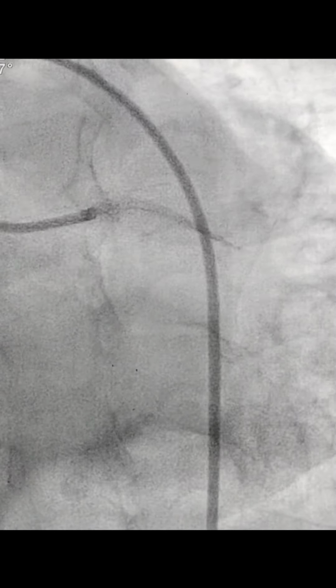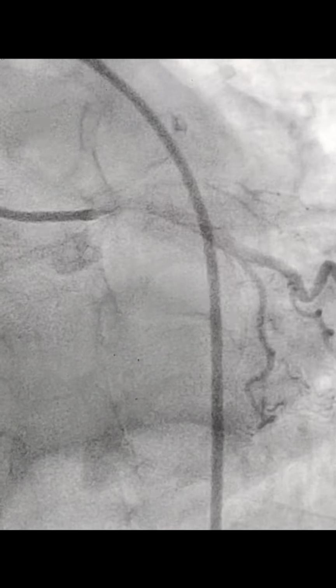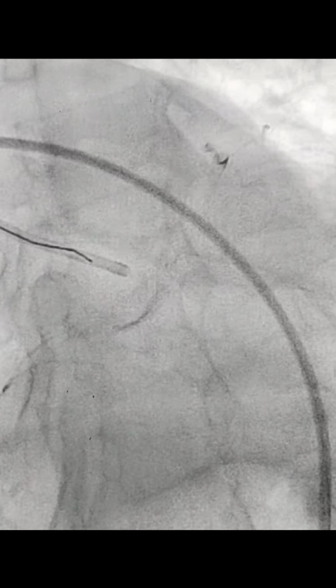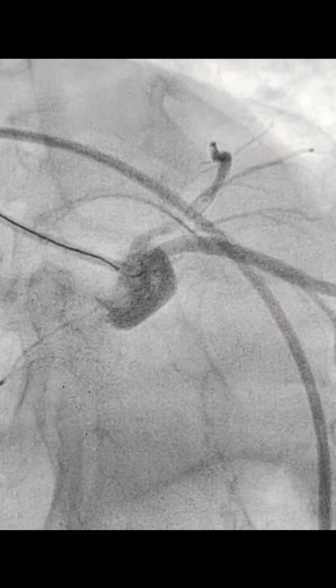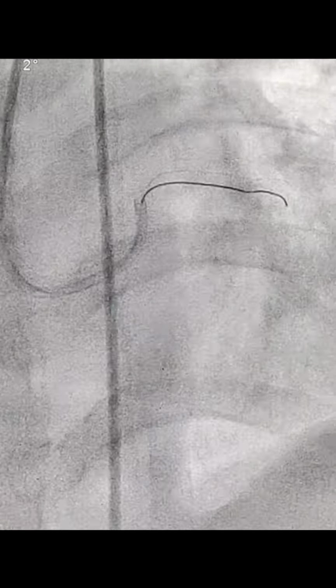So this angio we have done with the radial, and then it was difficult to get access in such a separate origin of LAD, and we don't know from where it is starting. So we changed the access to femoral, and this is the caudal view, and this was the XB catheter, and we tried to put the wire inside the LAD, but you can see there is a separate origin of the LAD. There is no LM, and the wire used to go in LCX only. So we changed the catheter from XB to JL. With much difficulty, we progressed the wire into the LAD with adjustment of the catheter.